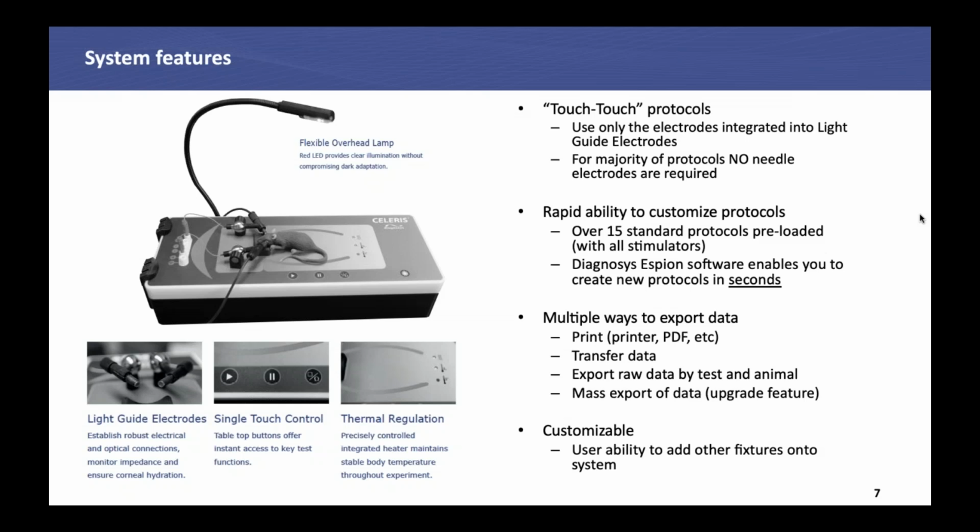Some who are doing RPE research might be interested in using that modality, and anything that we could possibly do. The only thing that you haven't done, but I think you can do it, is to do the 2-flash paradigm.